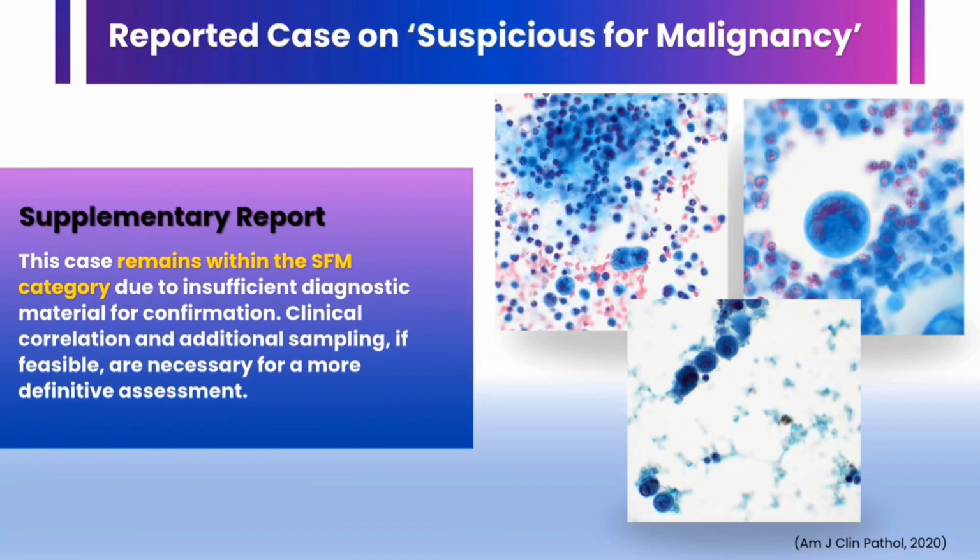And for the supplementary report, this case remained in the SFM category, due to insufficient diagnostic material for confirmation. Therefore, clinical correlation and resampling is important for a more definitive assessment.